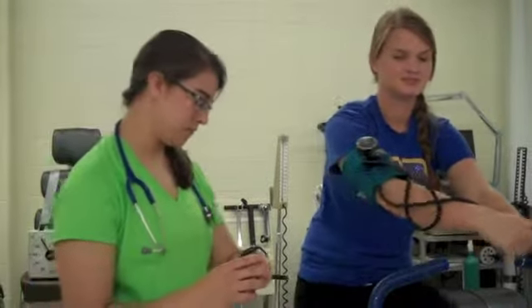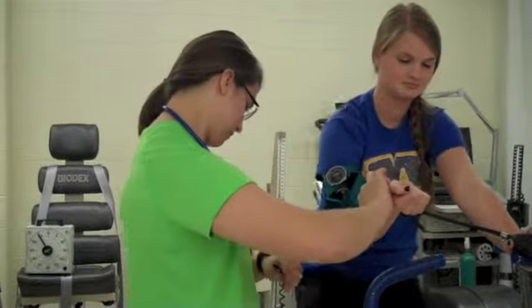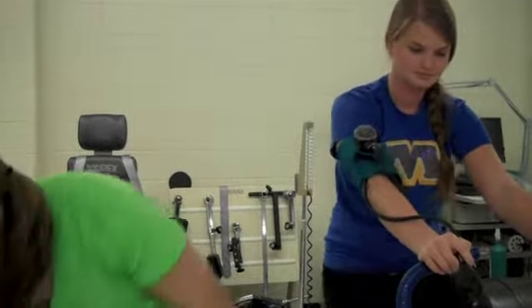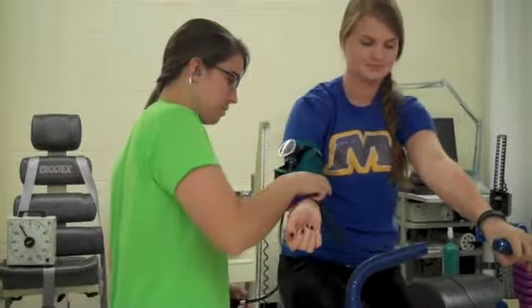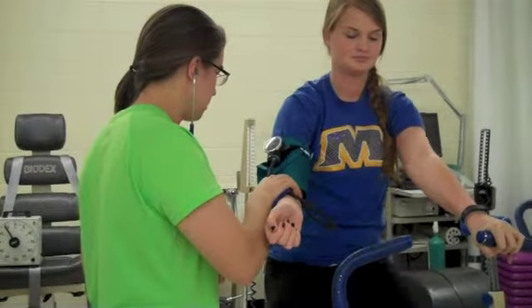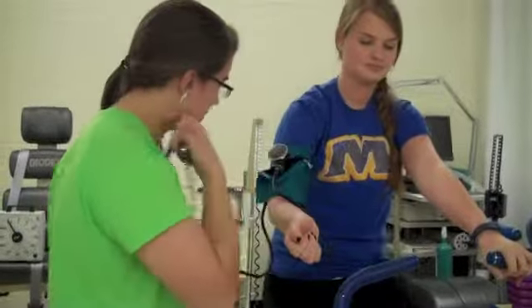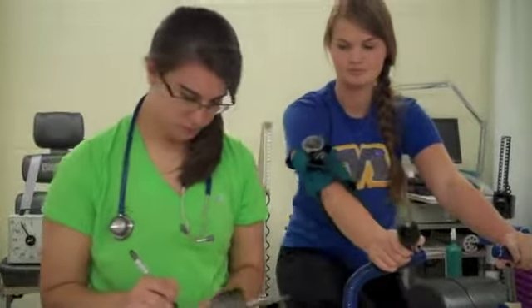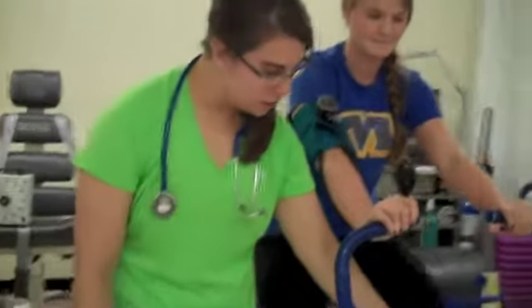About 5 more seconds, we'll take another one. Ashley's heart rate is now at 140. I will now take another blood pressure. Ashley's blood pressure is 128/84, so she's still doing good with that. Now that Ashley's heart rate is above 100, we're going to increase the workload to 2.0.